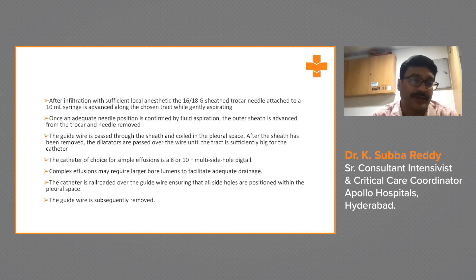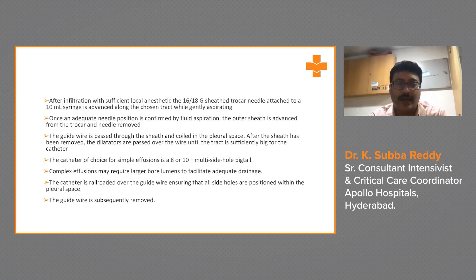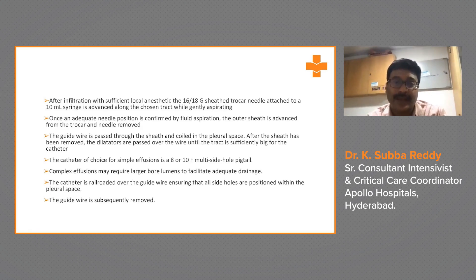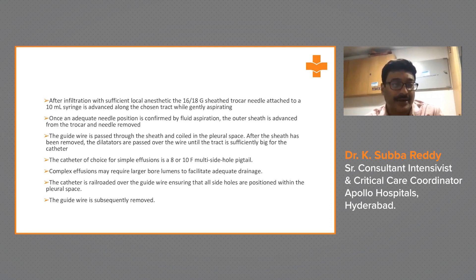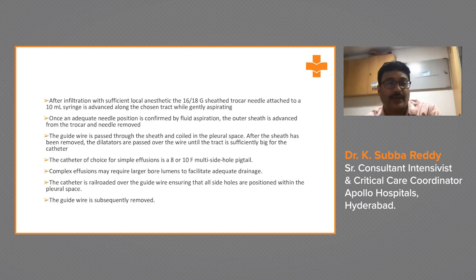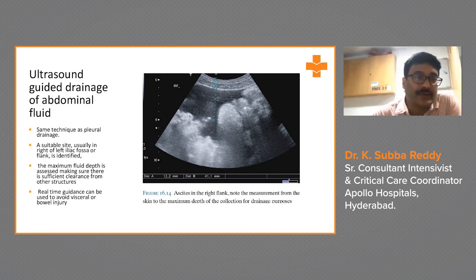After giving local anesthetic and confirming needle position by fluid aspiration, advance the outer sheath from the trocar and remove the needle. Pass the guidewire through the sheath and coil it in the pleural space. Remove the sheath, then pass dilators over the guidewire to create a tract large enough for the catheter. For simple effusions, an 8 to 10 French multi-hole pigtail catheter is used. Complex effusions may require larger bore lumens to facilitate adequate drainage and prevent blockage by debris. The catheter is railroaded over the guidewire ensuring all side holes are within the pleural space, then the guidewire is removed.